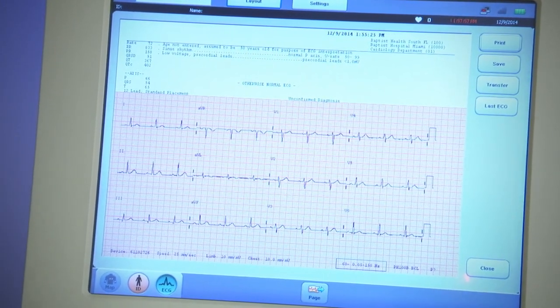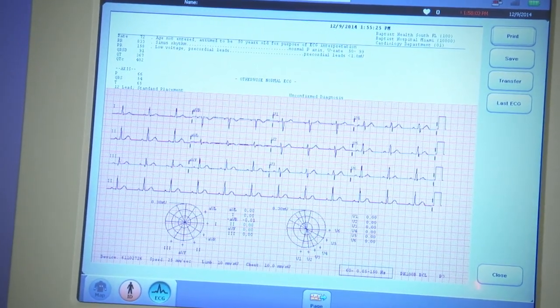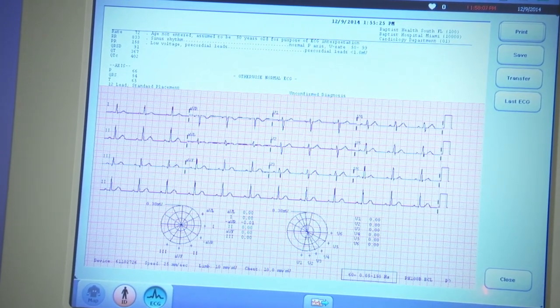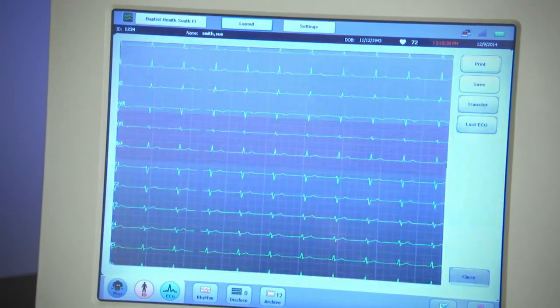For example, the three rhythm leads are shown here. This is an example of the 12-lead with lead 2 rhythm along with the ST maps graphically showing ST changes. This view shows all 12 leads simultaneously and may be printed as well.